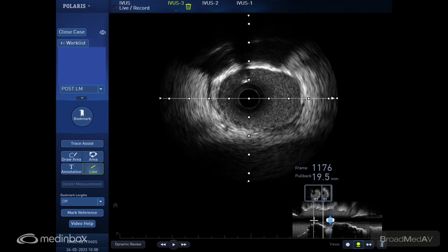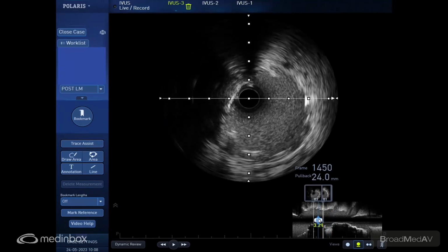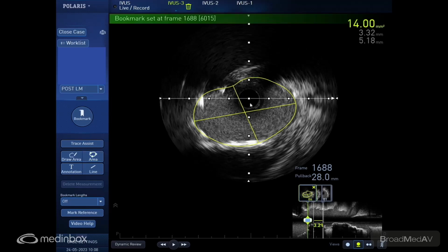What's the lumen at that area where it's malapposed, please? The length of the malapposition is 3.2 millimeter. Definitely we need to address it if more than 3 millimeter. No, I'm asking you the lumen area, the MSA at the ostial left main. I hope it is going to be 11, 12, or even more than this.